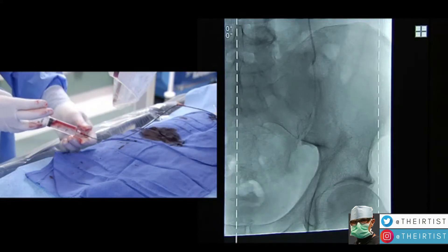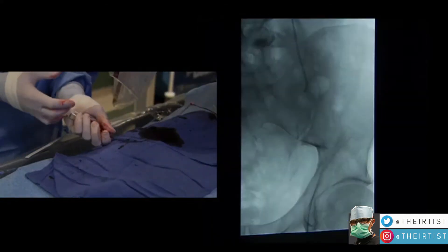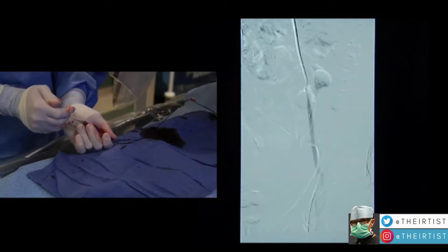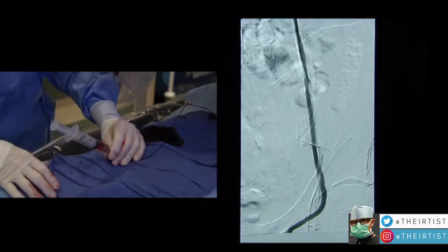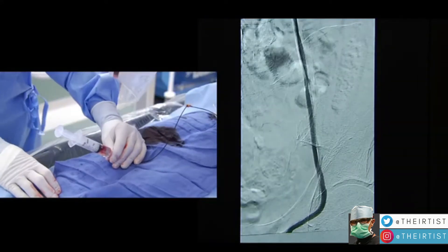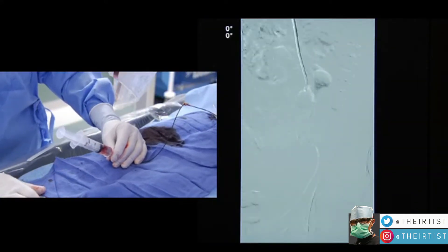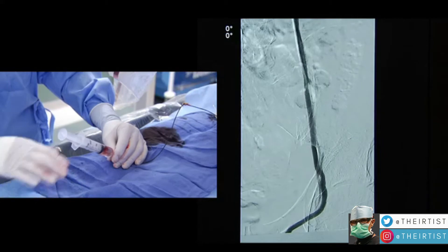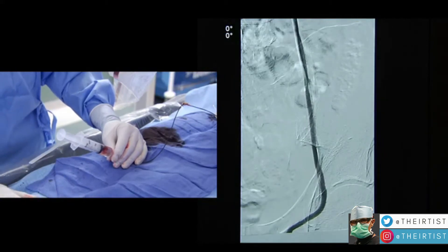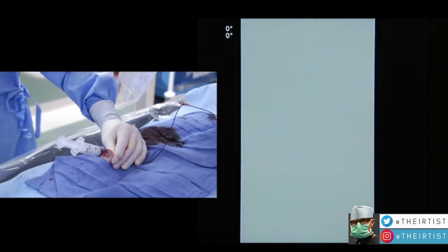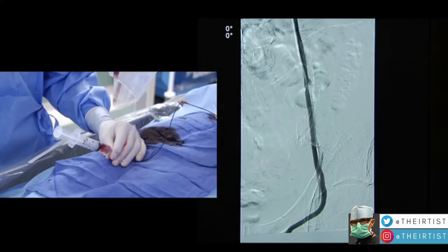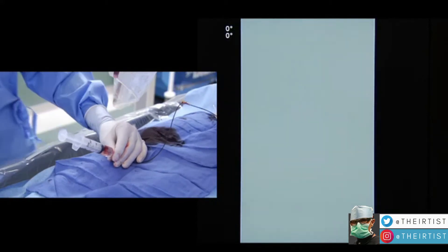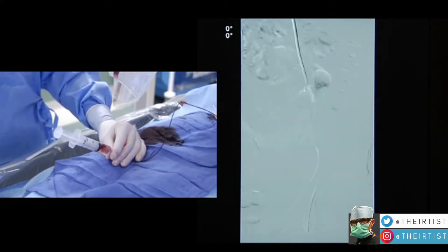The physician magnifies the image and performs selective venography. We can see a large prominent main vein with small collateral branches on the side. When left untreated, these tiny collaterals can cause recurrence of symptoms — however, they cannot escape the eye of the radiologist.